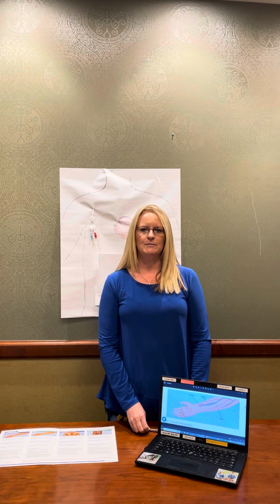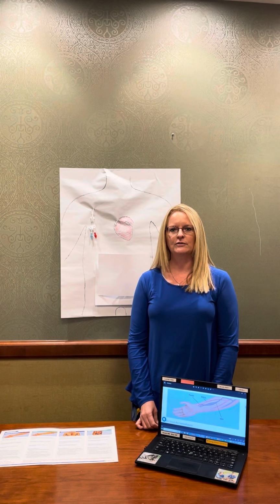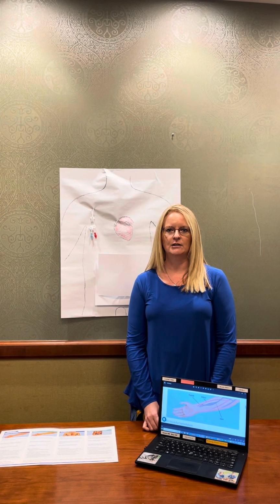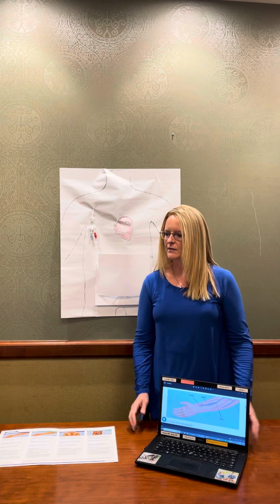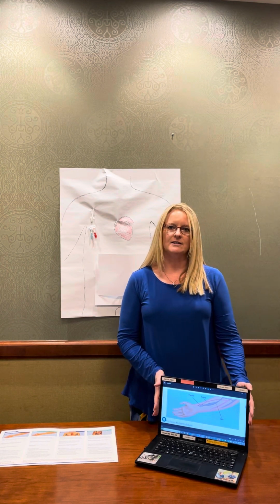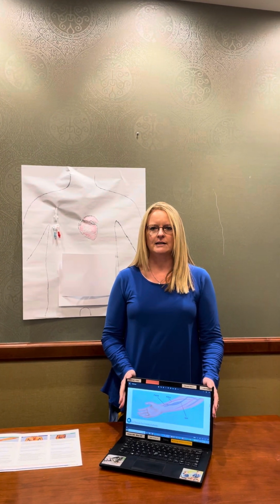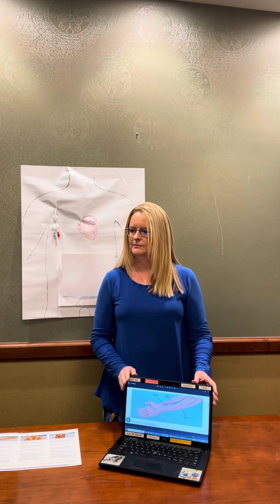There are 3 types of accesses that we can use to remove the toxins and fluid from the bloodstream, one of the ways that a patient can be on dialysis. Our first option is a fistula. This access is formed by taking the patient's own artery and own vein and connecting the 2 of them.